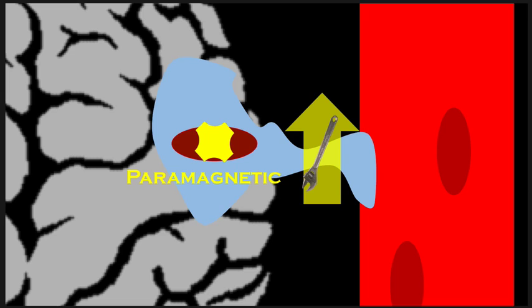So late in the first week, you're going to have lysis of the red blood cell. And as that occurs, the methemoglobin is going to spill out into the extracellular space. So everything that we've been talking about before this happening has been intracellular. But now that red blood cell is getting older and older, it's been living in a clot for a week, and it starts to crack and leak. Now the significance of that is that methemoglobin that was strongly paramagnetic, that was creating that T2 star effect, is now going to leak out.